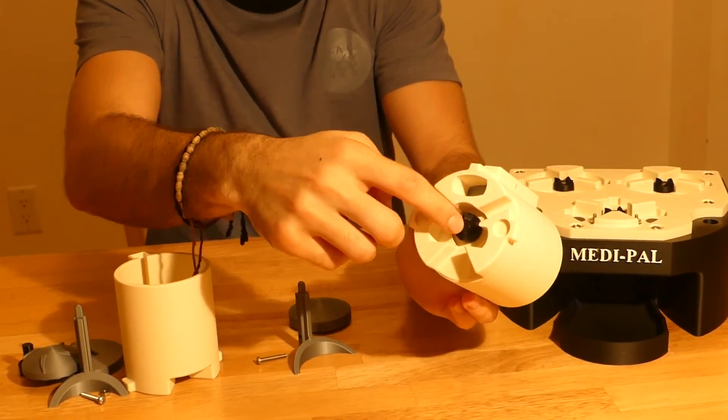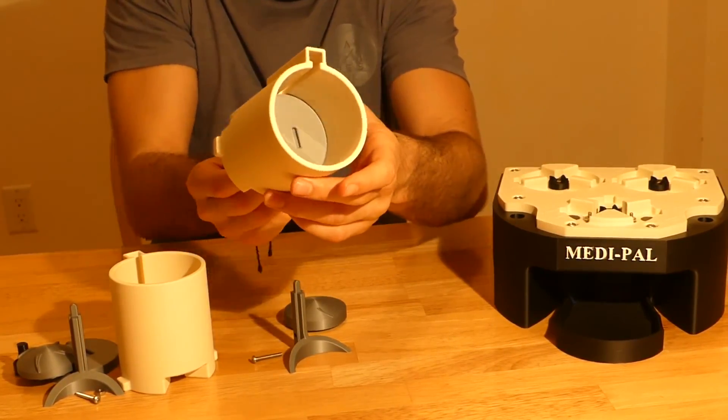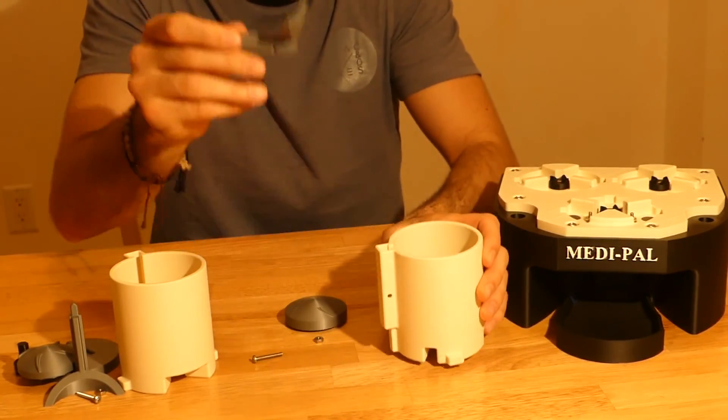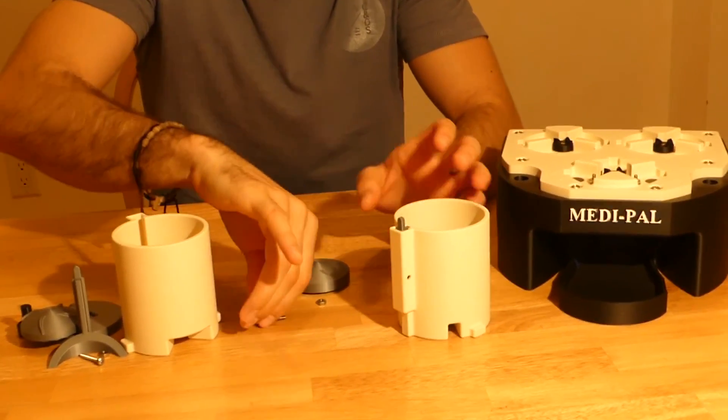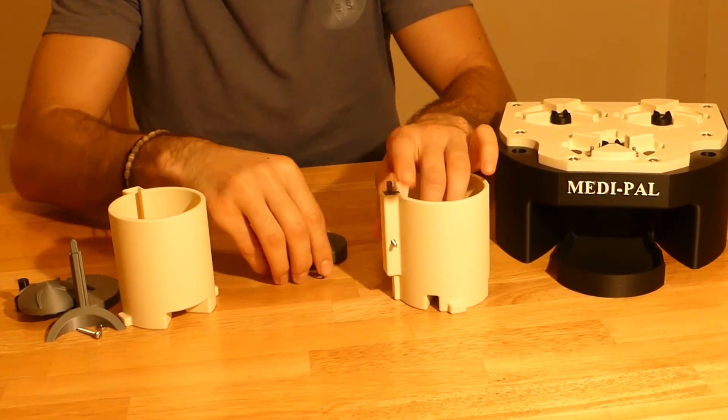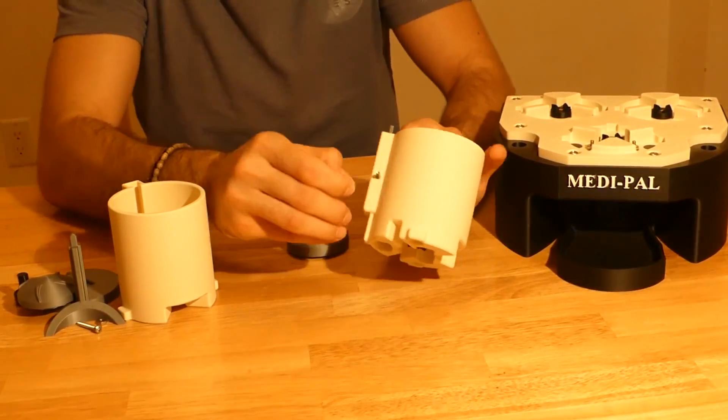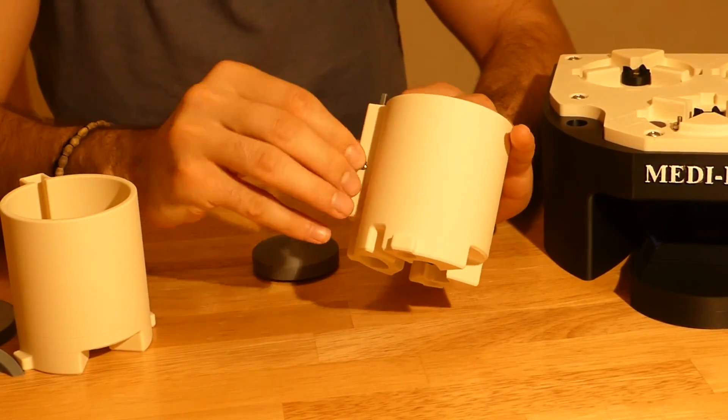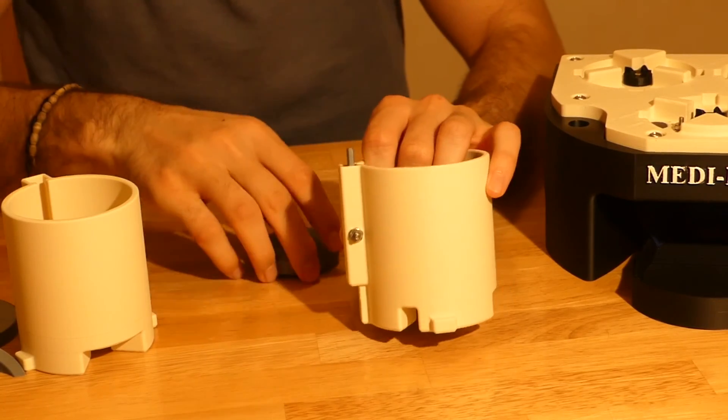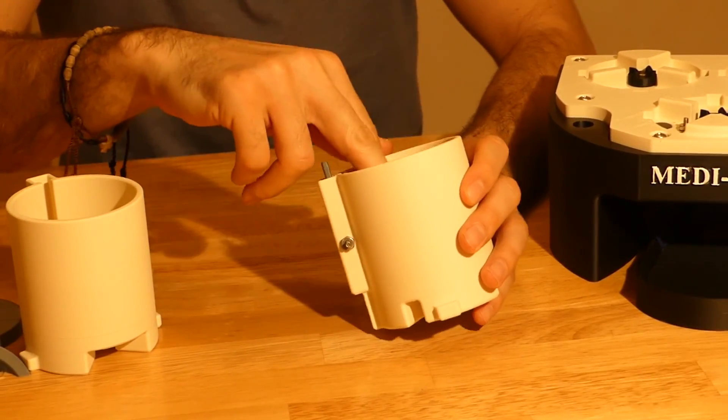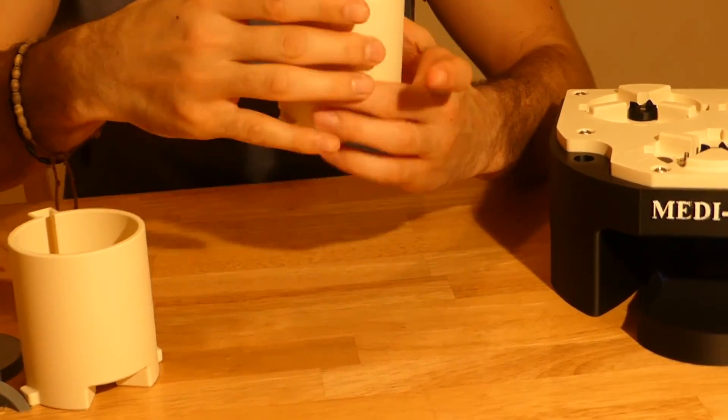This allows the rotation from the cylinder gear to be transferred to the rotating disc. Next, the sweeper arm slides in and is secured with its screw and nut. Then the agitator piece gets added to the rotating disc.